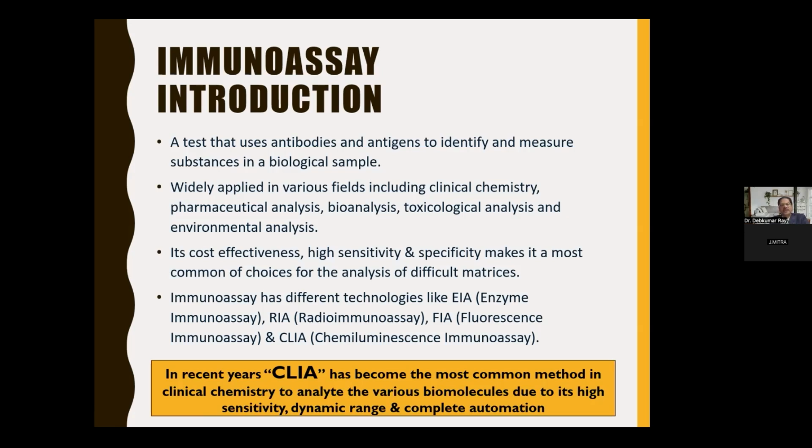It is widely applied in various fields, including clinical chemistry, as well as pharmaceutical analysis, bioanalysis, toxicological analysis, and environmental sciences, where different organic materials are analyzed in environmental analysis. The cost effectiveness is a very important component of this assay, as well as the high sensitivity and specificity, which make it a most common choice for analysis of difficult matrices.